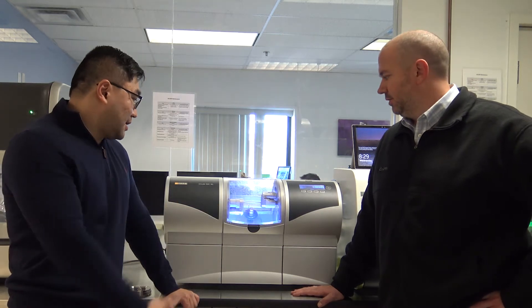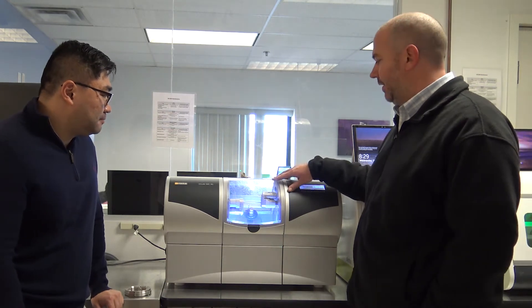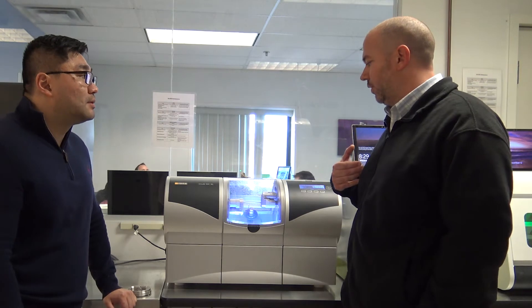Hello everyone, welcome back. We are here in the milling room with Jay Black with our MCXL. Jay is going to give us a quick rundown of the MCXL. Well, the MCXL is a wet mill. It has four motors and it can mill pretty much anything. I mainly use it for glass ceramic.